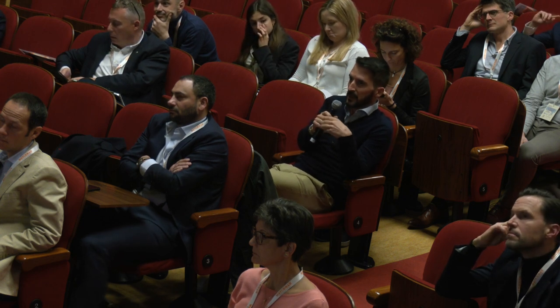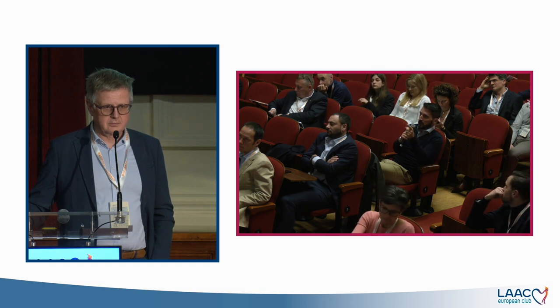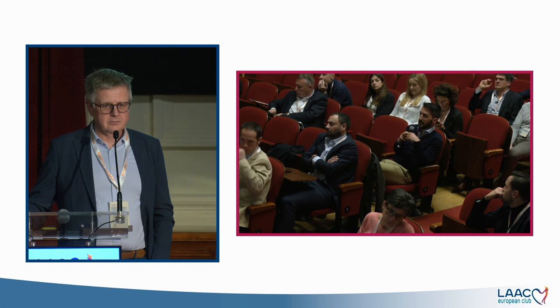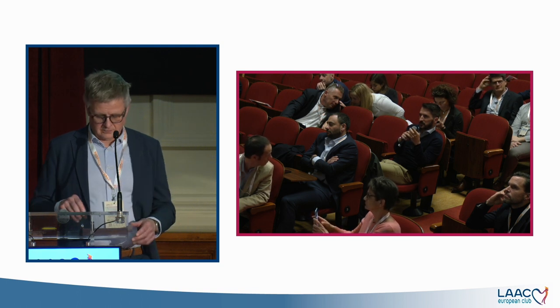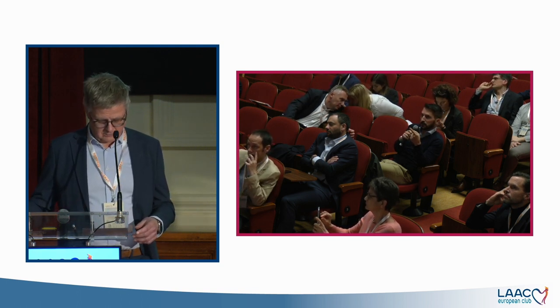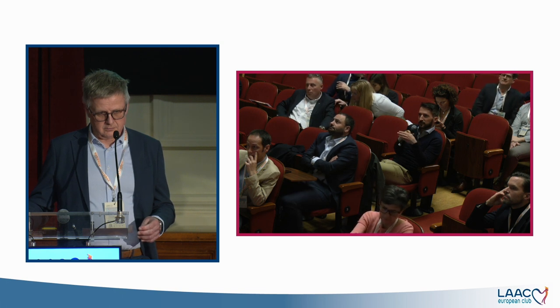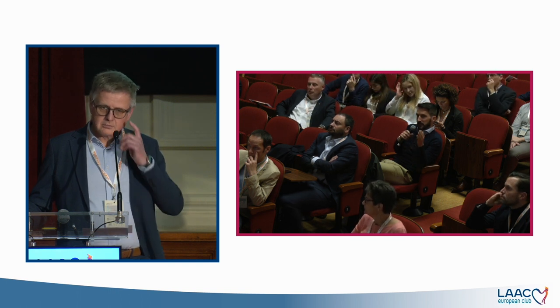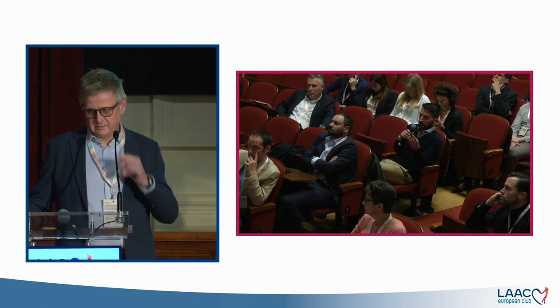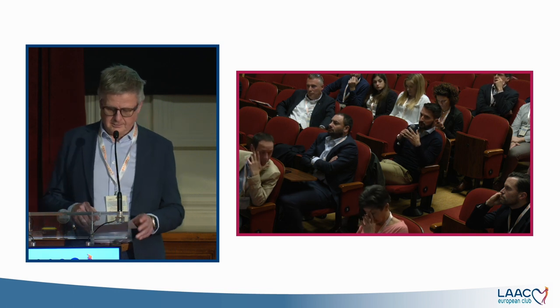That would be the explanation behind it. So, in my opinion, these are the three points you can take into consideration to grade a procedure as simple or very challenging. Because if you have to go through all of these, what does it mean if the anatomy is simple, but you have a close relationship to the pulmonary artery? Does a close anatomy to the pulmonary artery make it already challenging? I would again make this very simple and have these three criteria: ostium narrow or wide, angulation sharp or not, and the space that you have available.